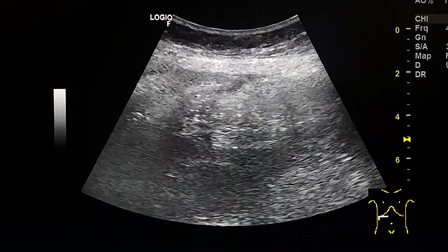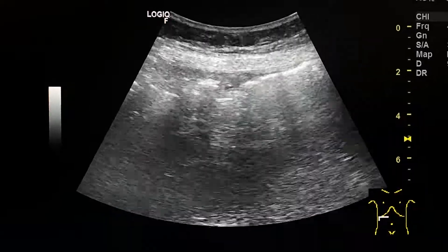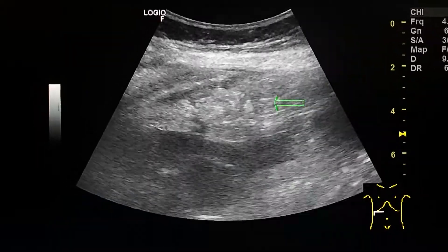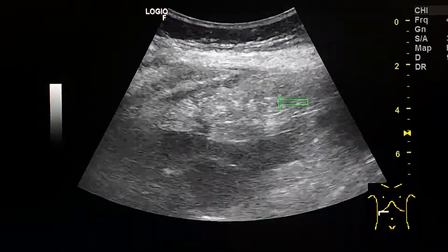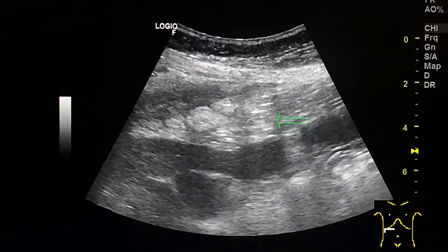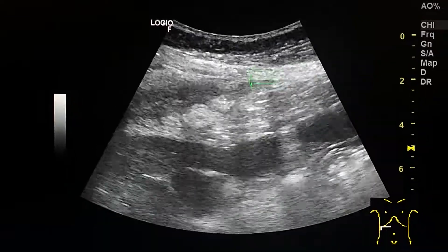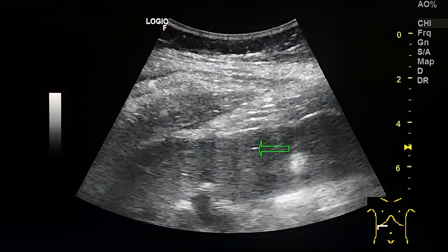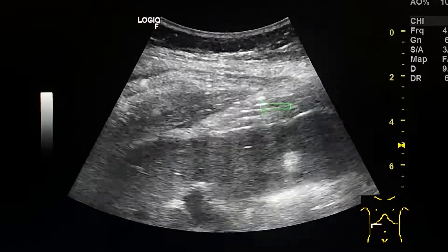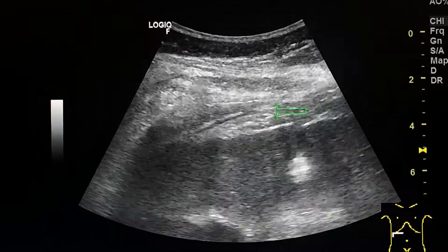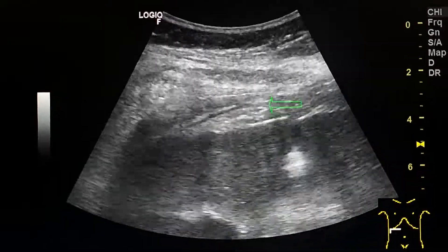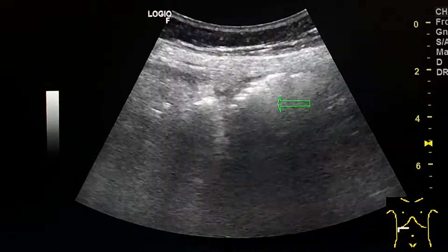Now the same pain and the same sonographic findings are present in the patient. Here we see a focal echogenic area of omental fat, fusiform in shape. We see it between the abdominal wall and the inferior anterior edge of the liver. It is painful by clinical examination, and adjacent abdominal organs are normal.